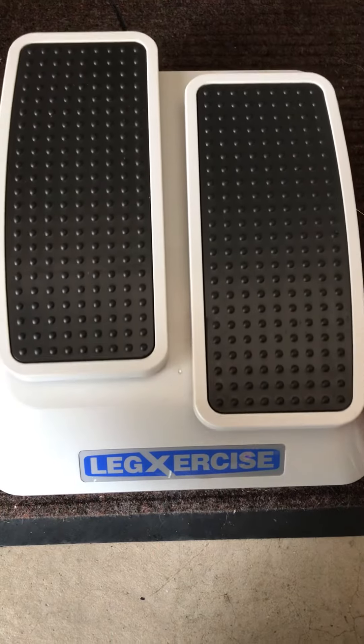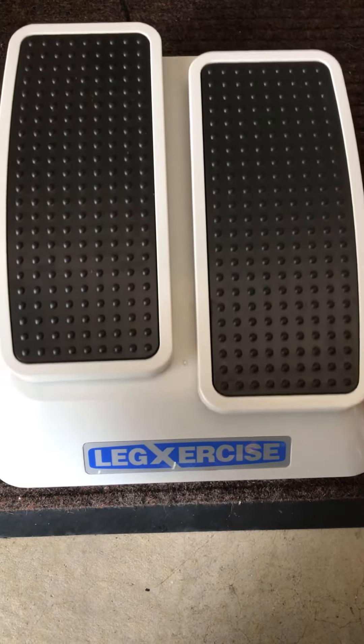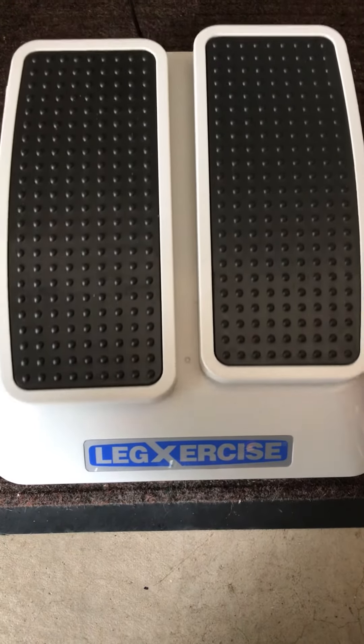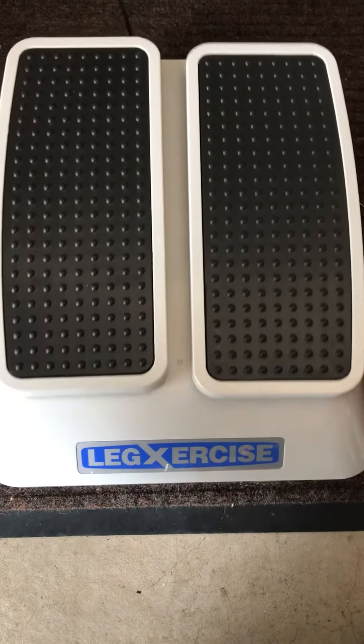We got a speed one. It kind of keeps your knees moving. If you have like DVT stuff or you had knee surgery, I think doctors kind of recommend stuff like this.